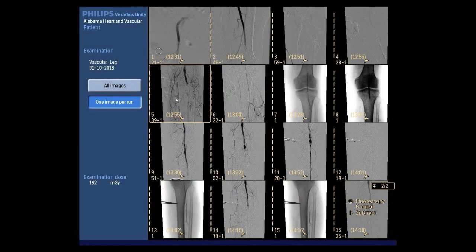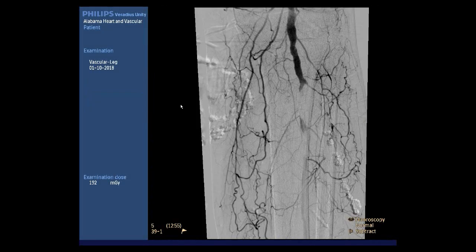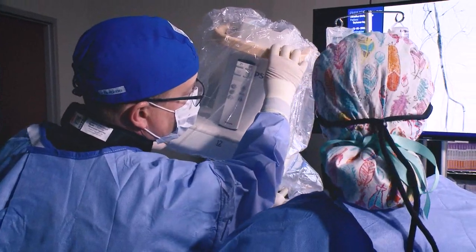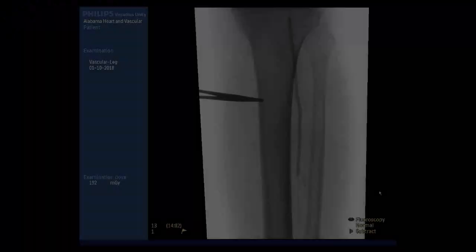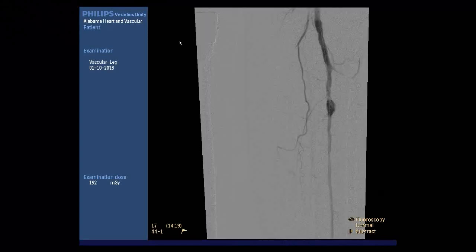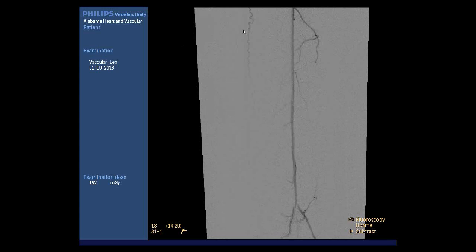Just yesterday, we treated a patient who came in with lower left leg ischemia. It was very important that there was one single vessel runoff that had a very tortuous takeoff. The ability of the Veradius C-Arm to be manipulated to a certain angle and provide excellent image quality allowed us to wire this vessel, and in turn balloon and do an atherectomy there, which essentially provided the blood flow her leg needed to keep her foot.